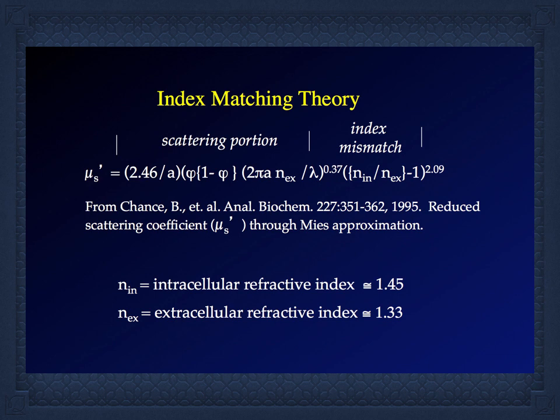And it's funny because I think I mentioned this in a previous talk. In the early days when we first started showing OCT images of various non-transparent tissue, I did a presentation at a Gordon conference. I think it was at Dartmouth, and then the next speaker came up with scattering theory and said that OCT would never penetrate more than 300 microns. And so somewhat of a disconnect there.